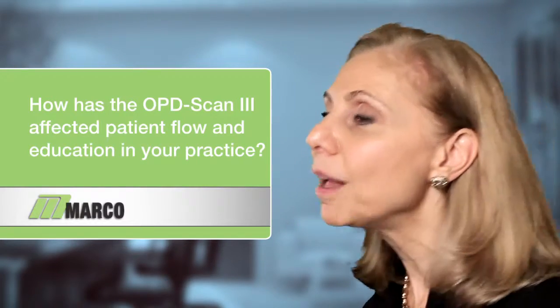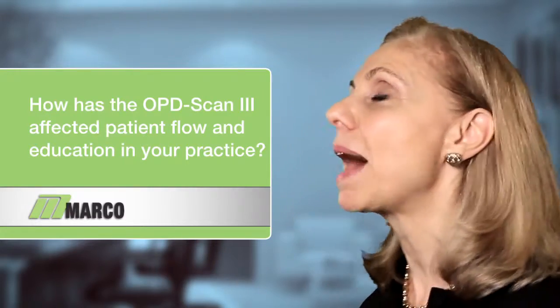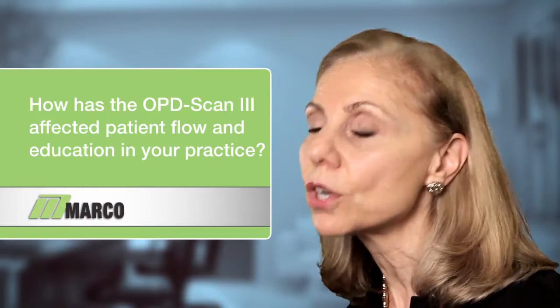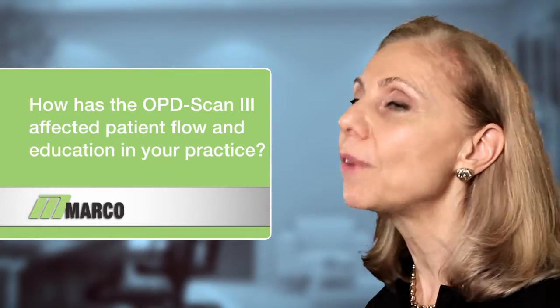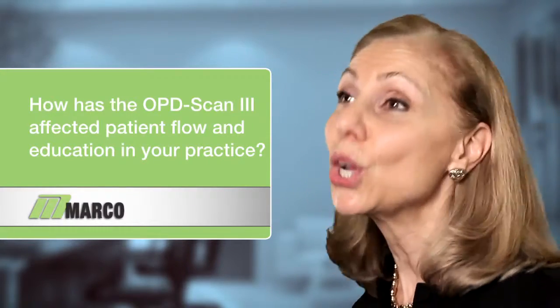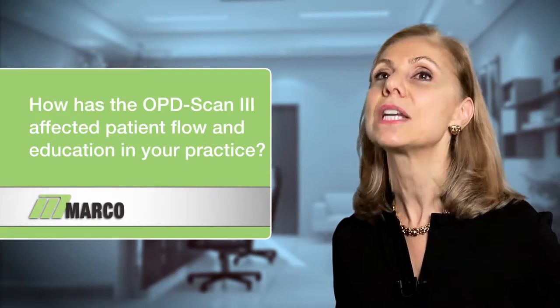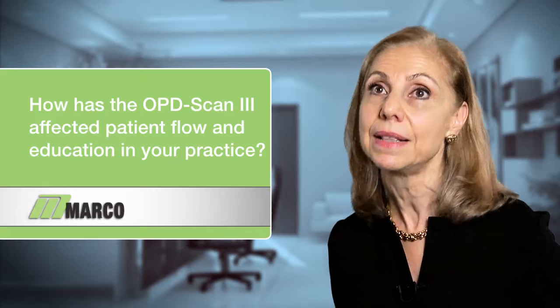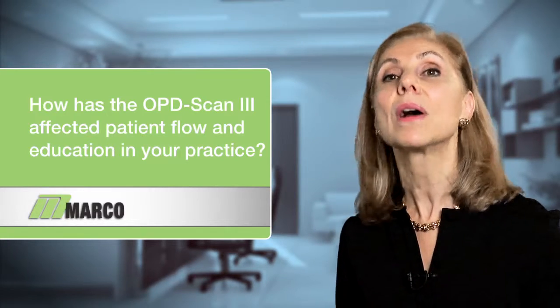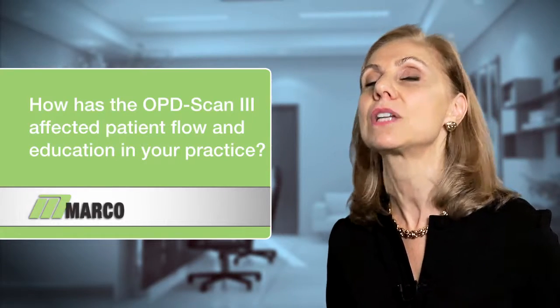I am able to help the patient, quote unquote, see their astigmatism by pointing to the bow tie pattern that is displayed on the monitor. This really helps the patient finally understand what this nebulous word astigmatism is to a lay person. Moreover, the family members get it too because they're seeing the bow tie, they're seeing the astigmatism, or they're seeing their positive angle kappa, where the visual center is way off from the anatomical center of the pupil.